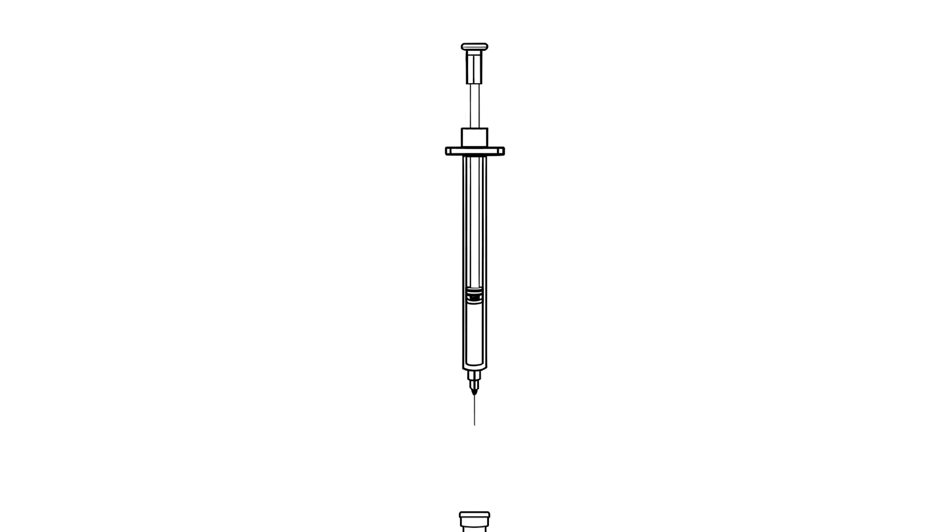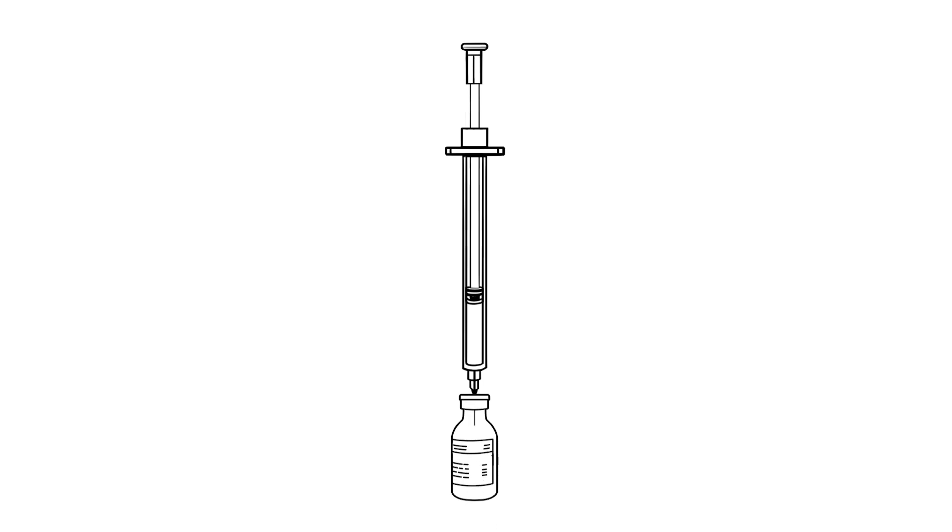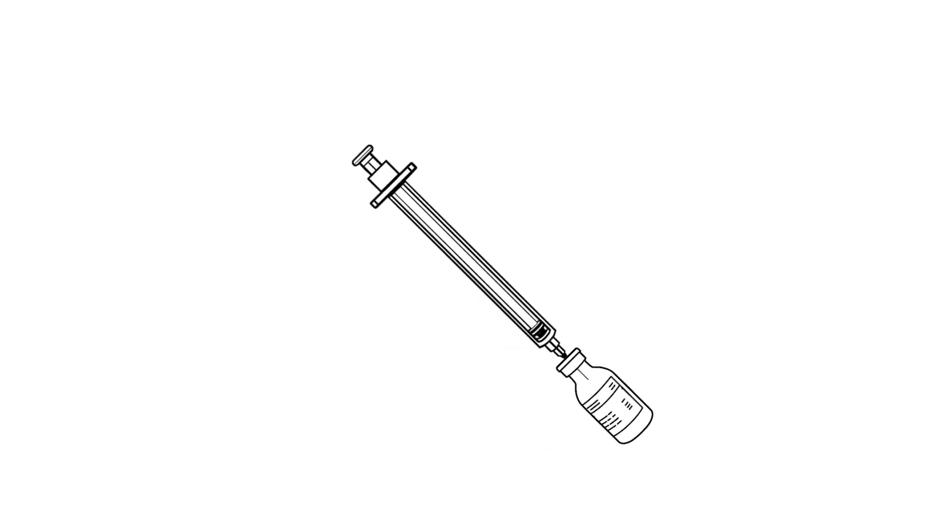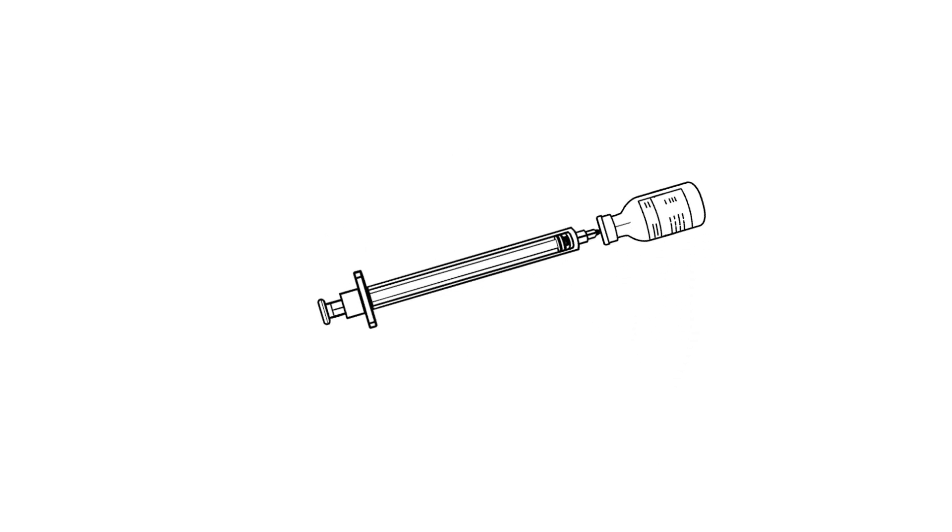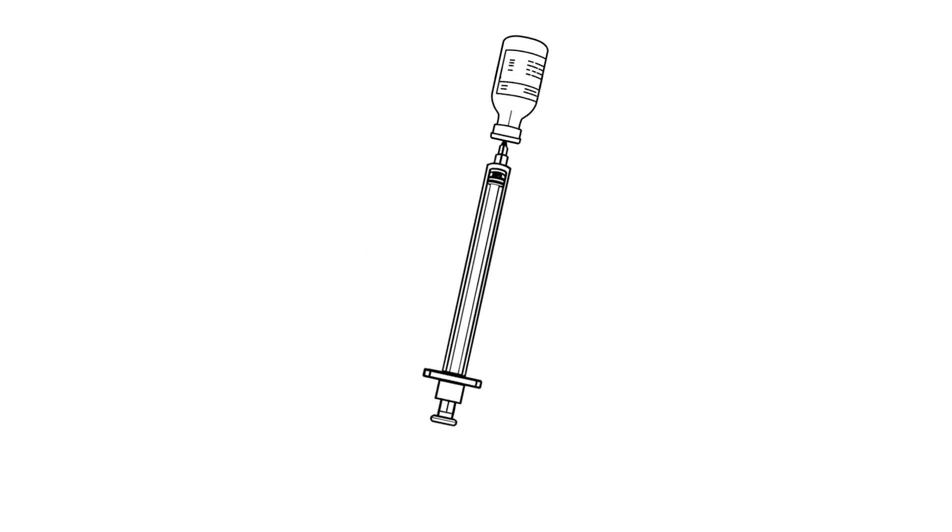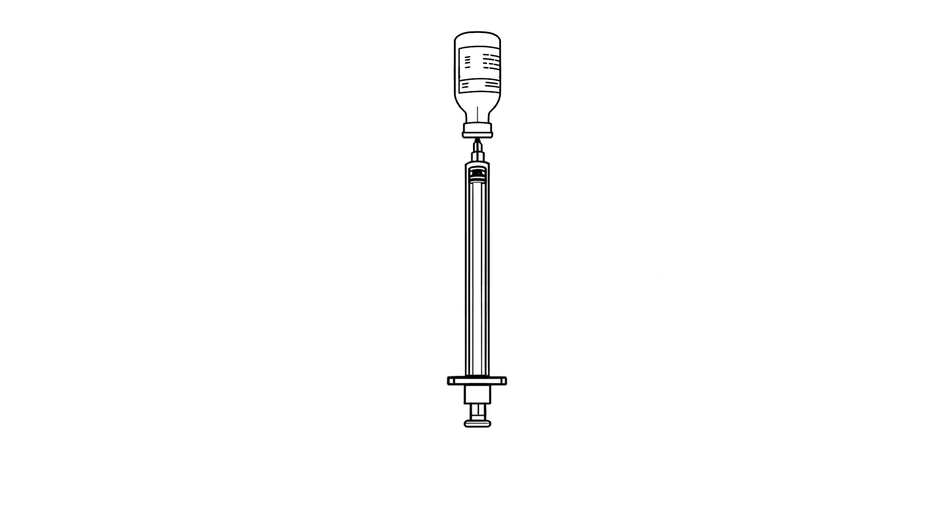Now push the syringe needle into the top of the insulin vial. Press the plunger to put the air into the vial. Turn the syringe upside down. Make sure the tip of the needle is in the insulin liquid. Pull back on the plunger to fill the syringe with the right amount of insulin.